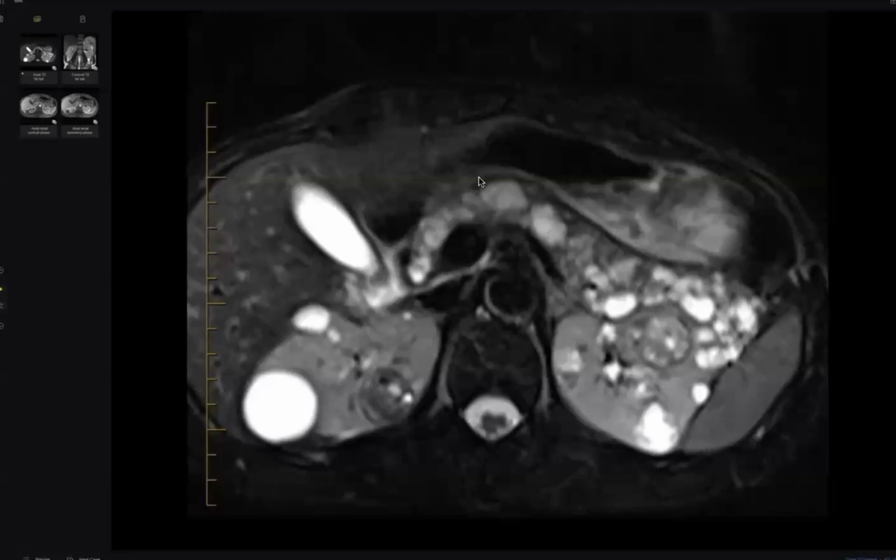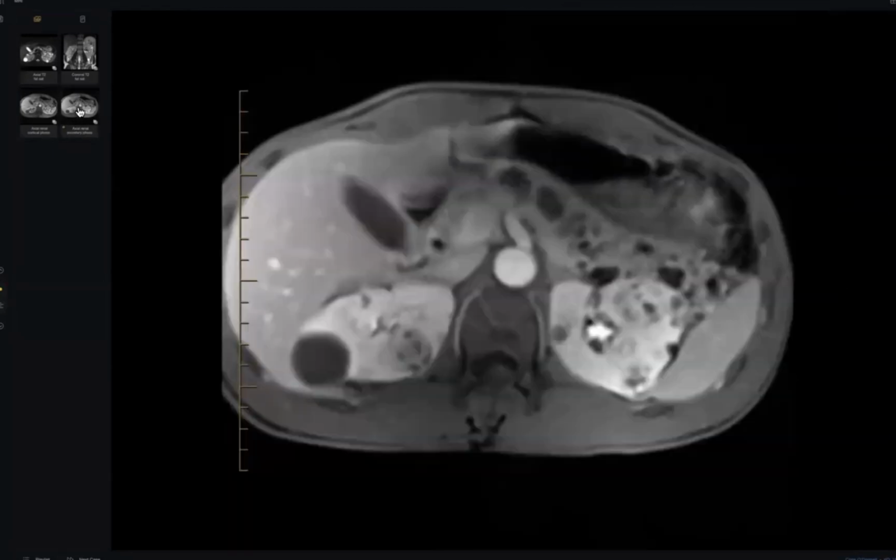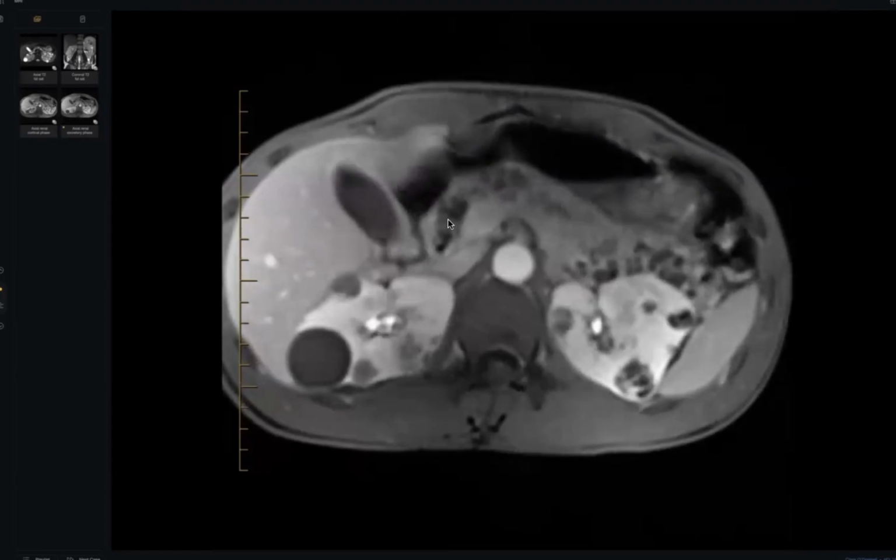Thank you, doctor, so much. Take care, my colleague. Even bilateral RCC is diagnostic or raises suspicion for von Hippel-Lindau. Even if you find just one RCC here and one here, you must make a note about von Hippel-Lindau. But here it is pathognomonic. Doctor, why is this not tuberous sclerosis?